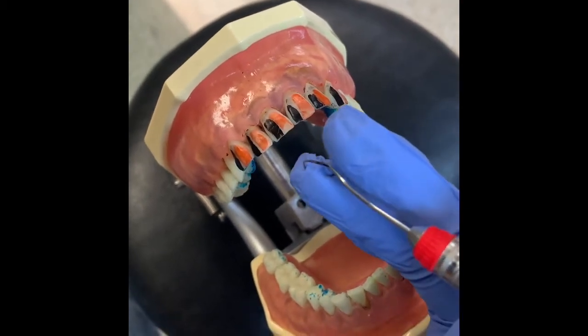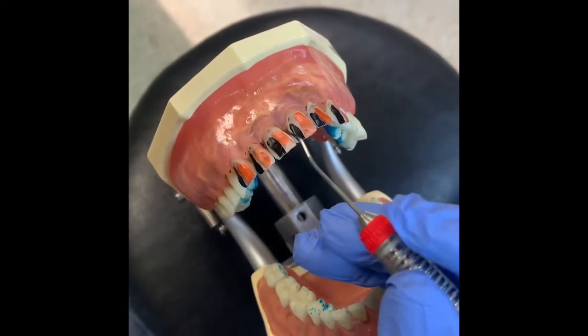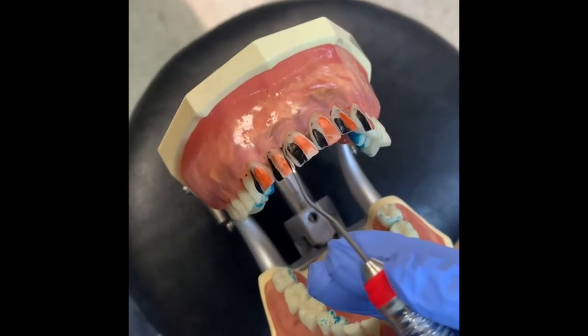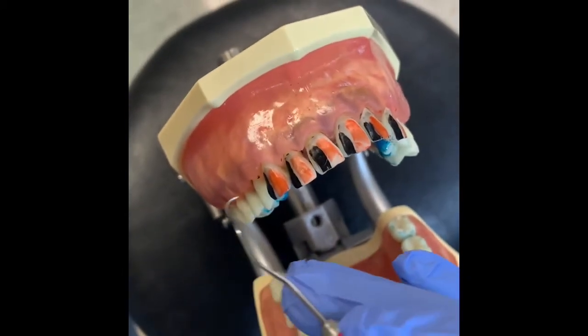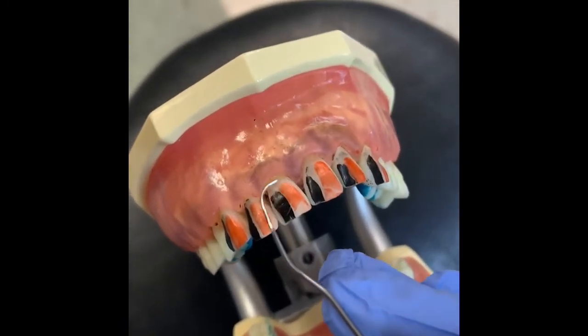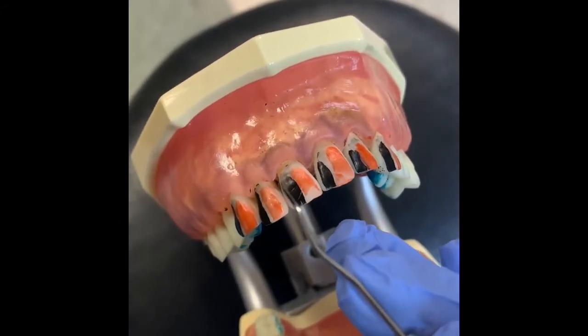Remember, we're looking at that little V, the bend there. So if you're looking at the terminal shank. When you're adapting your Explorer to the anterior, we start at the middle of the tooth. So posterior teeth, we start at the distal buccal line angle. Anterior teeth, we start at the middle of the tooth. Now, I want you to look at the adaptation.